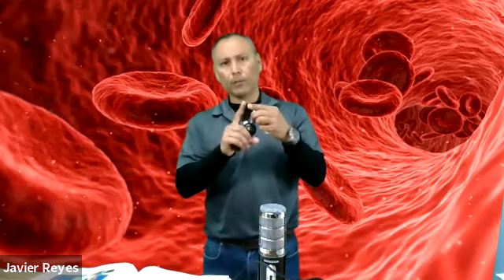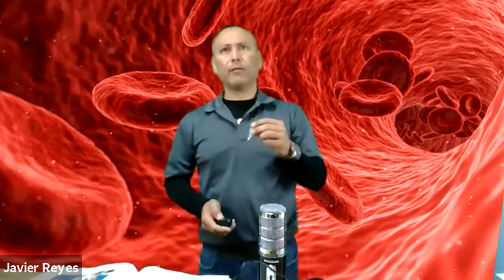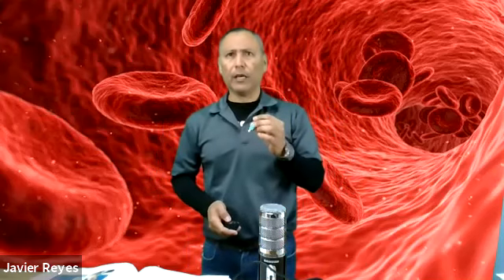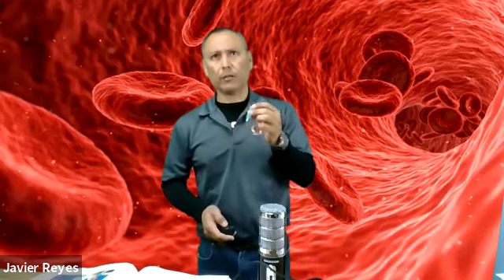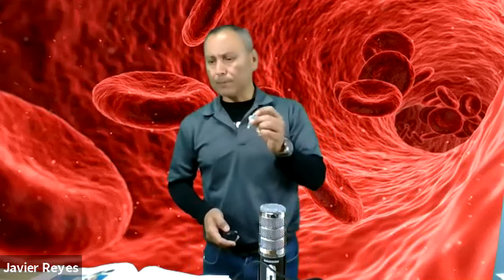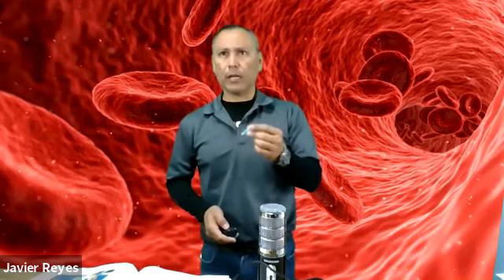So these again, they're designed for either finger punctures or heel punctures, as it is on newborns. Finger puncture lancets come in various forms, and the color will determine the depth of the puncture. That means how deep the needle is going to go in the skin. We don't want to use one that is too deep on an infant, because it will cause damage to the bone, and we'll talk more about that in a minute.